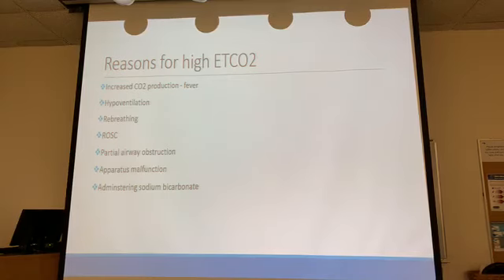Reasons for a high end-tidal CO2. Well, if you got a patient that's running a fever, they tend to have a high end-tidal CO2. Their body's producing a lot of CO2. Hypoventilation, patient's not breathing enough, they're building up a lot of carbon dioxide in their lungs, it's gonna be high. If they're rebreathing, let's say they're on the vent or you're bagging them and you're not giving them enough time to fully exhale, what's gonna happen? All that carbon dioxide is not getting blown off. You start seeing that carbon dioxide level go up. You need to stop bagging so much and give them some time to exhale.